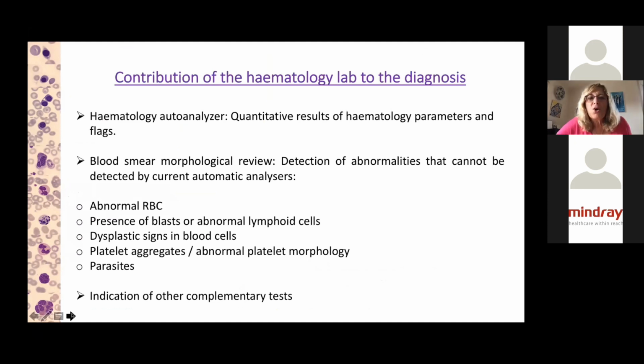So what is the contribution of the hematology lab to the diagnosis? The hematology analyzer provides quantitative results of hematology parameters and flags.